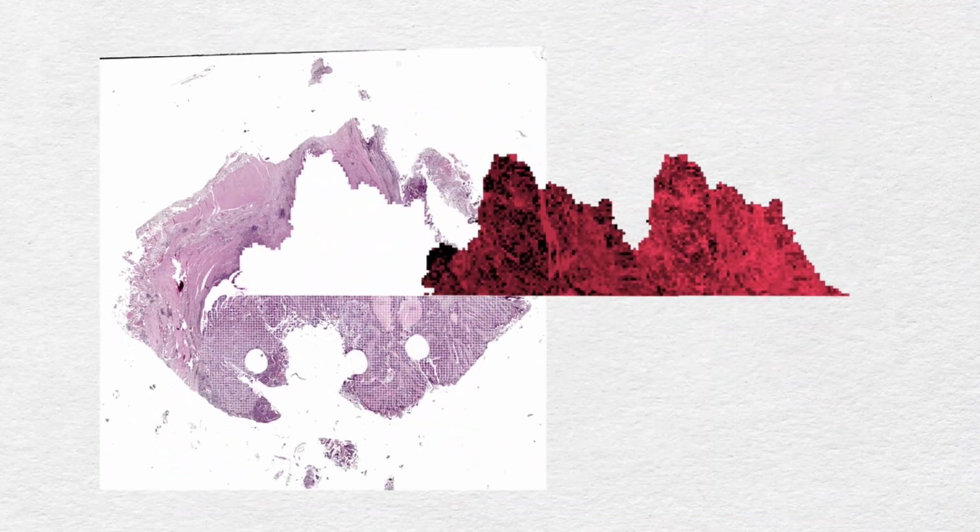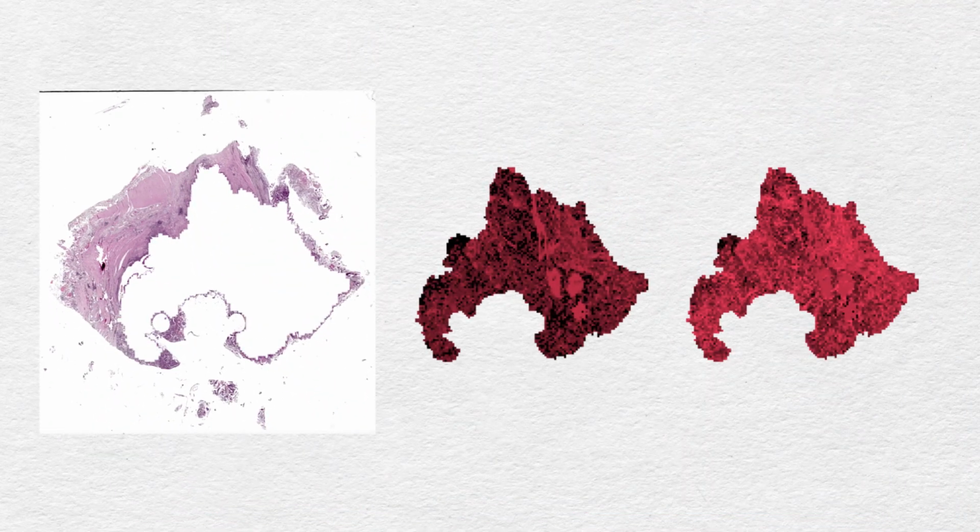This network consists of a representation network and a pooling function. After all tile representations are computed, the pooling function collects all tile representations and performs an operation, reducing them to 2 numbers. A pair of values is calculated for each tile and registered in respective heat maps. This concludes the first network.